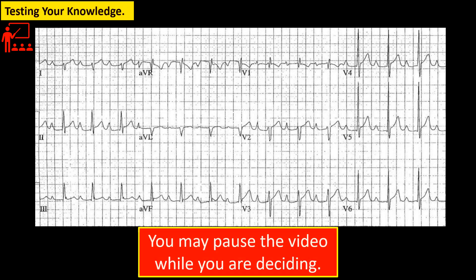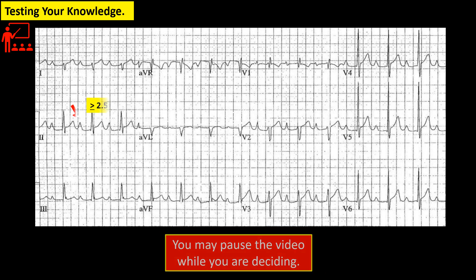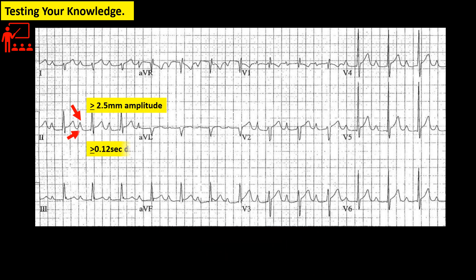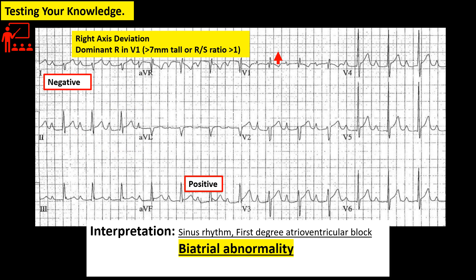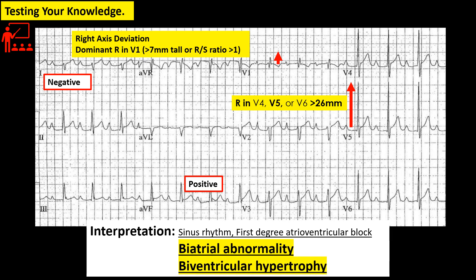How about this tracing? What is your reading? There is sign of right atrial enlargement and left atrial enlargement — so biatrial abnormality. Moreover, this tracing fulfills the criteria for right ventricular hypertrophy and voltage criteria for left ventricular hypertrophy, so this is also biventricular hypertrophy. And that is the end of our lecture.